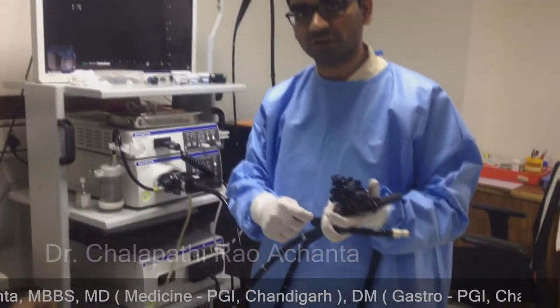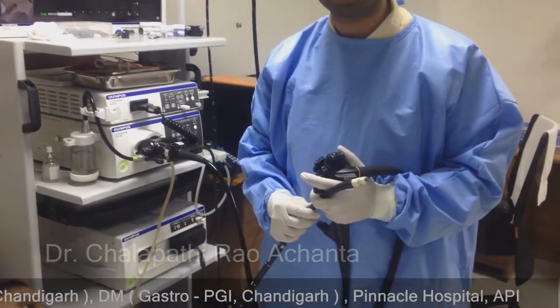By doing the biopsy and FNAC needle, we will do tissue sampling. This is the patient's pancreas problem.